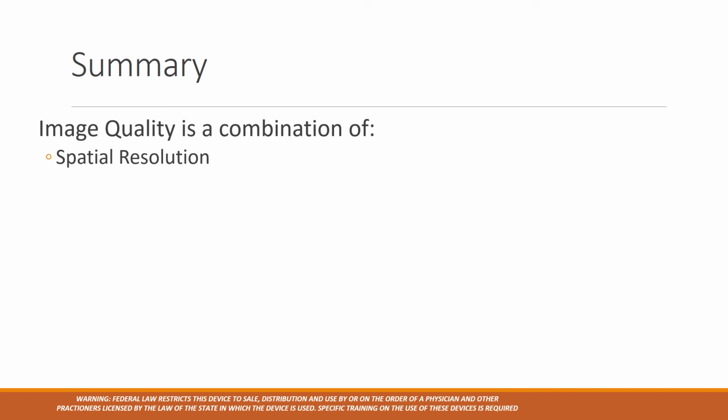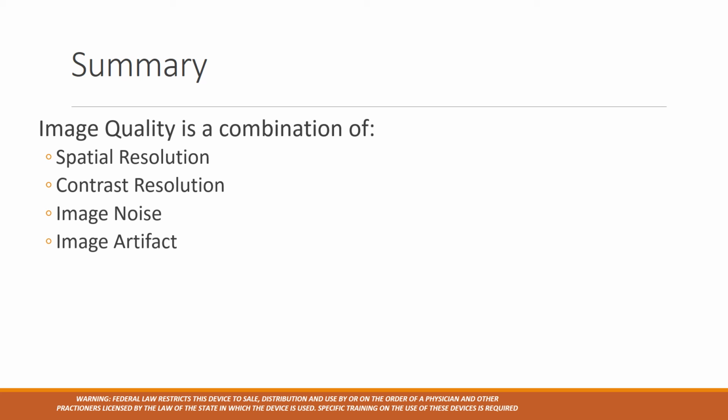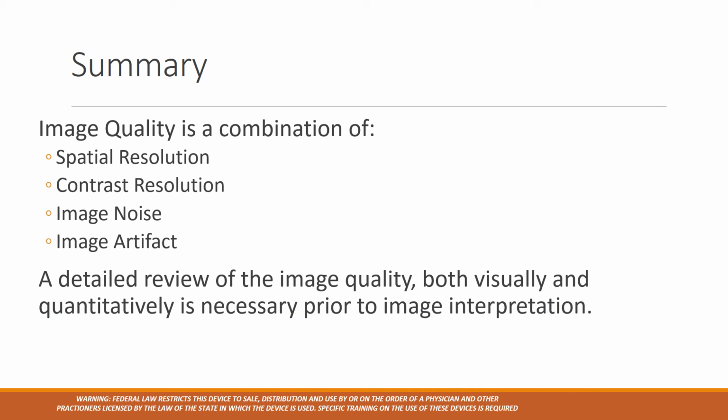In summary, image quality is a combination of the spatial resolution in the image, the contrast resolution in the image, noise, and the presence or absence of any imaging artifacts. A detailed review of the image quality, both visually and quantitative, is necessary prior to the image interpretation.